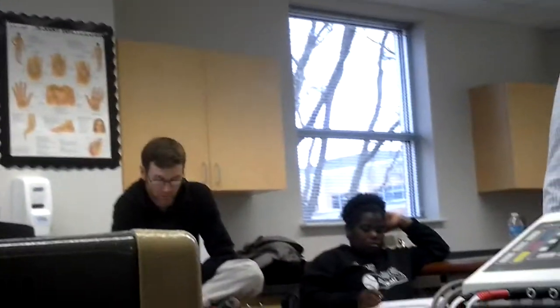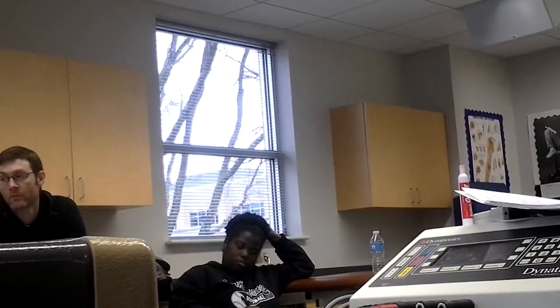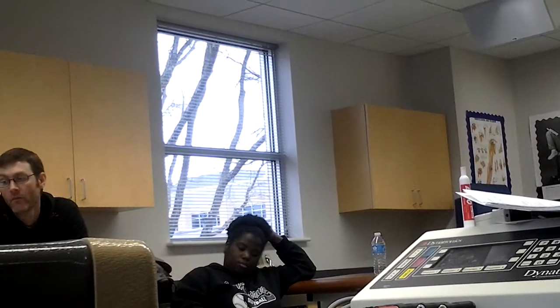What about on surge? So you really get the same thing. On reciprocate, you get dorsiflexion because it's trying to go to the second channel, but it's not on the body. On surge, you just get the same thing. So you basically get the same outcome. Okay, all right, good for page 70.